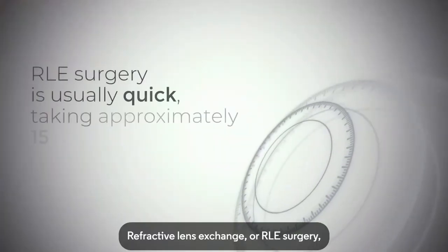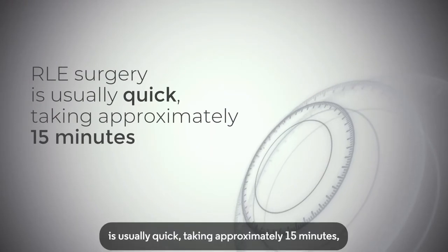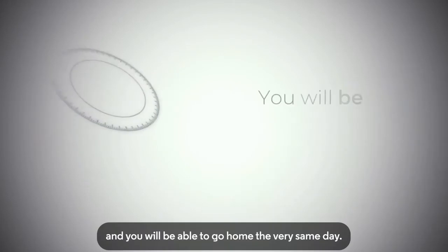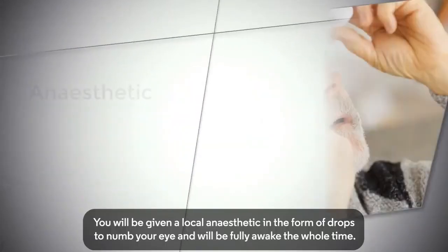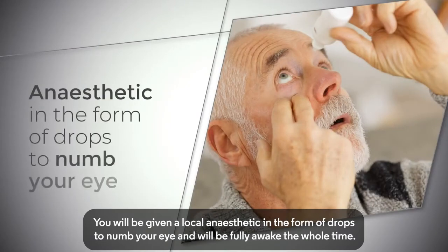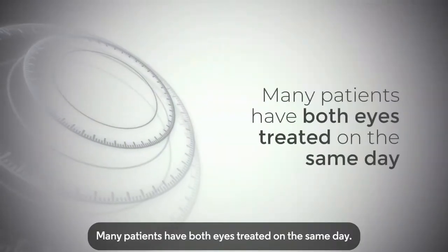Refractive Lens Exchange, or RLE, surgery is usually quick, taking approximately 15 minutes, and you will be able to go home the very same day. You will be given a local anaesthetic in the form of drops to numb your eye and will be fully awake the whole time. Many patients have both eyes treated on the same day.